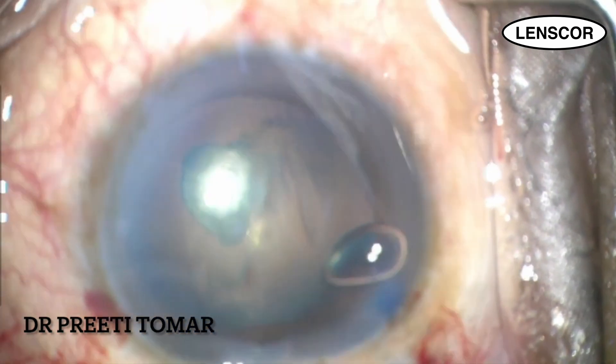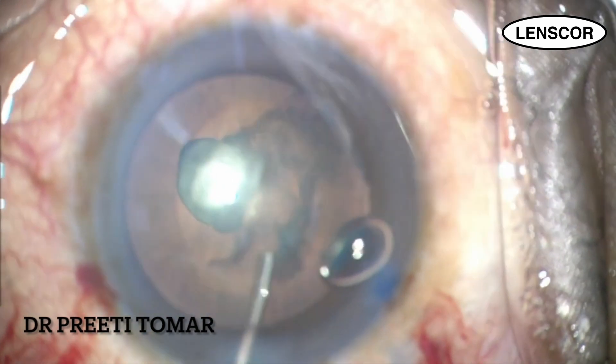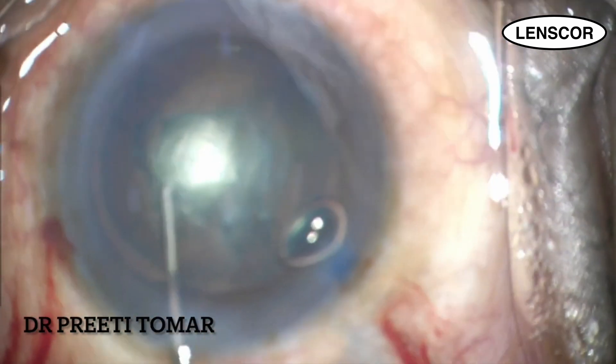Hydrodissection is contraindicated in posterior polar cataracts, so we go ahead with gentle hydrodelineation. Here I am trying to confirm the right plane.